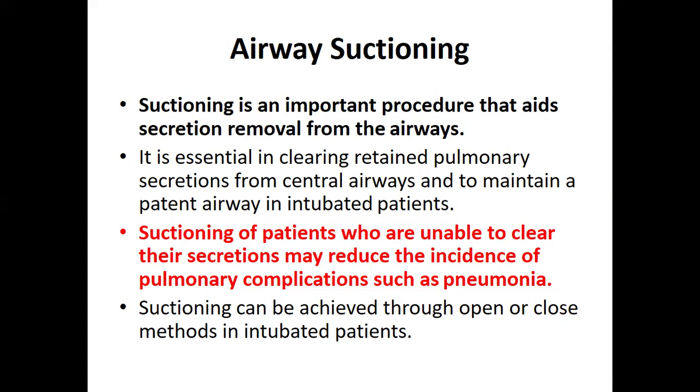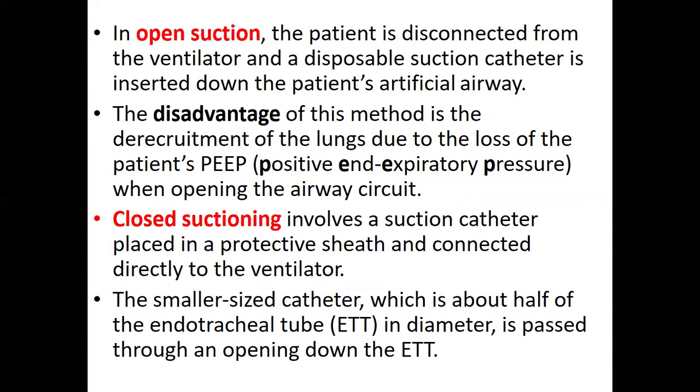Patients like those in ICU have depressed capacity to clear their own airways, so secretions are produced and collect in the airway lining. Suctioning comes in very handy in clearing secretions in this type of patient.